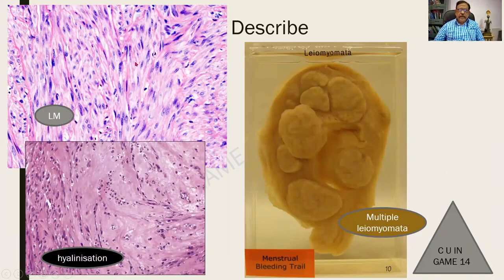In the slide over here, I am finding the longitudinal view of it, and this is the cut surface of the same tumor cells. You can draw any one of these diagrams. This also is kept as a slide in some centers, and I am finding that the tumor cells are being separated by homogeneous, eosinophilic, pale, acellular material, and this is called hyaline. Hyaline is some material that is being deposited in the degenerative areas. So this is called hyaline change in a leiomyoma. Hyaline change in a leiomyoma can be kept as a slide. Otherwise, leiomyoma by itself is a slide.